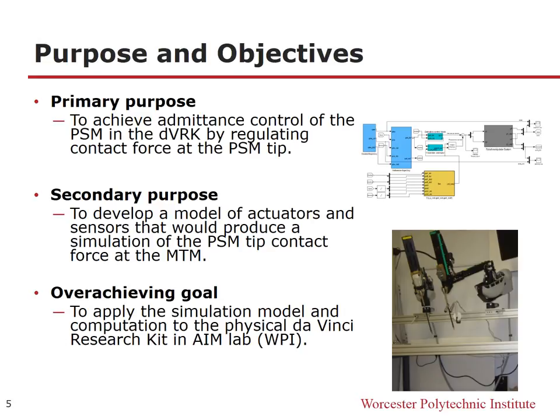Our secondary purpose is to develop a model of actuators and sensors that would produce a simulation of the PSM tip contact force at the main tool manipulator, or MTM, which is on the surgeon side. For this, the objective is to provide the operator of the MTM, that is the surgeon, to experience a similar force or the same force at the PSM tip. For the secondary objective, we shall monitor the contact force at the PSM tip and measure the artificially produced force by the modeled actuator sensor system at the MTM.